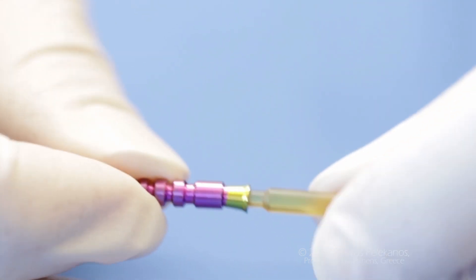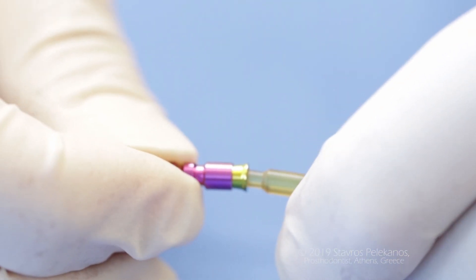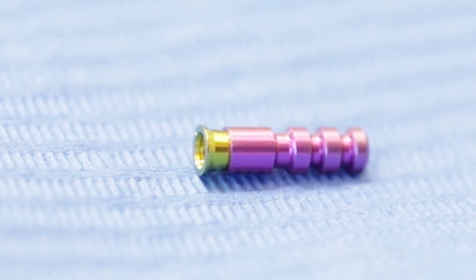Another benefit of this abutment is that it's solid — it's one piece. And in combination with a tight conical connection, it prohibits contamination from the oral cavity internally to the implant.